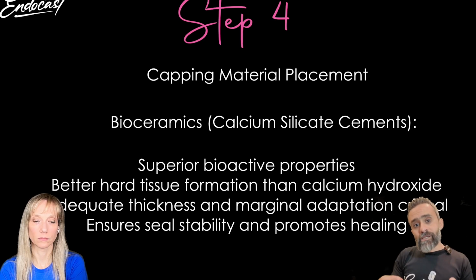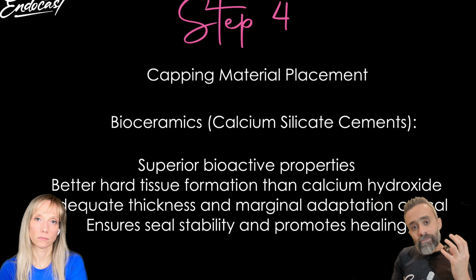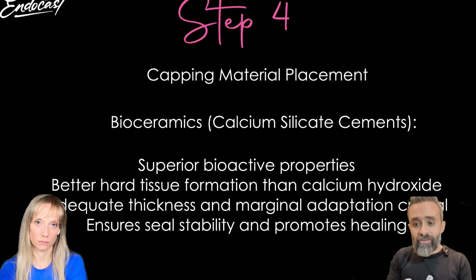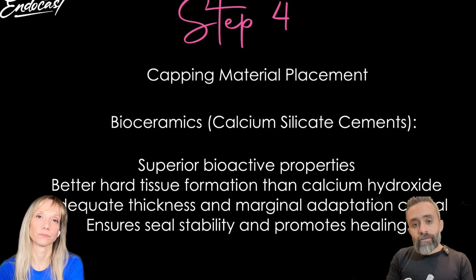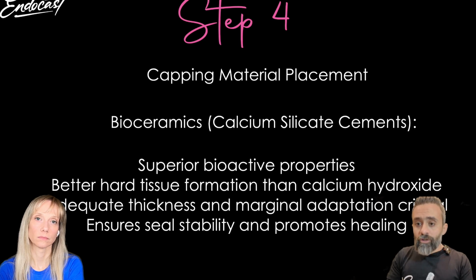Whether the pulp stump is an exposure for direct pulp capping, or a partial pulpotomy, or the pulp stumps are at the orifices of the root canal, we leave the material and we protect it from the acids that we used in the restorative procedure, as you saw in the previous videos, and then we can go to the restoration and follow up.